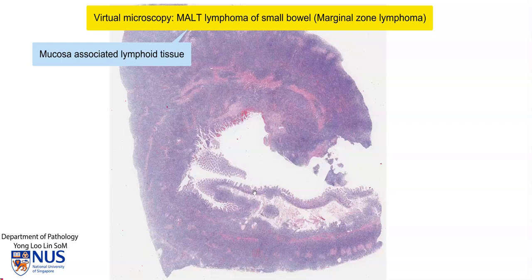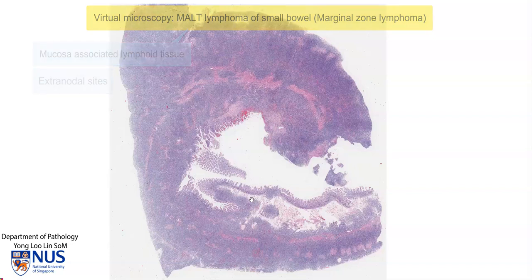MALT lymphomas, as the name suggests, do not involve lymph nodes, but rather they involve extranodal sites, such as the gut. They can also involve other organs, for example, the thyroid or salivary glands.